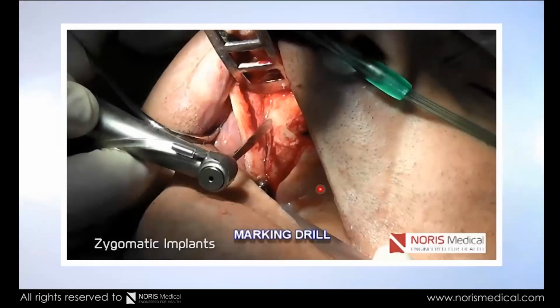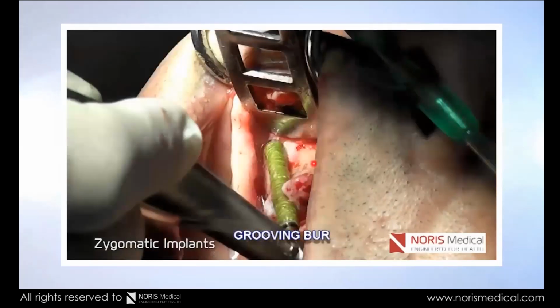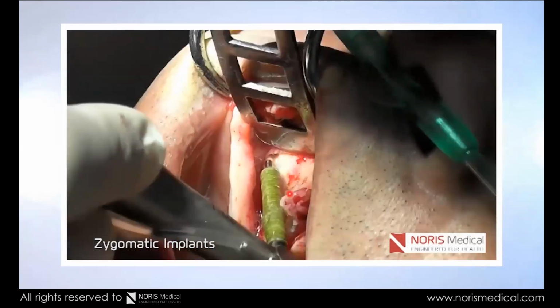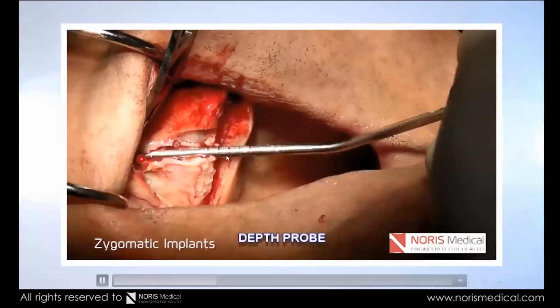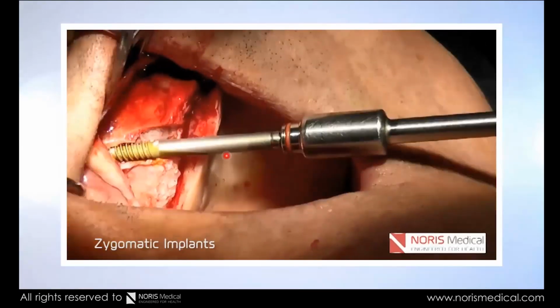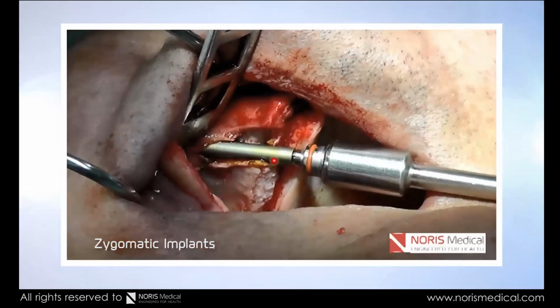So let's look at the procedure. And entering positioning was defined. The diamond tool is actually making the groove on the maxillary sinus wall. After that, a drill is being drilled. The depth of the implant is being measured. An implant is being positioned. Basically, if you see, the groove becomes a bone guide for the drill.